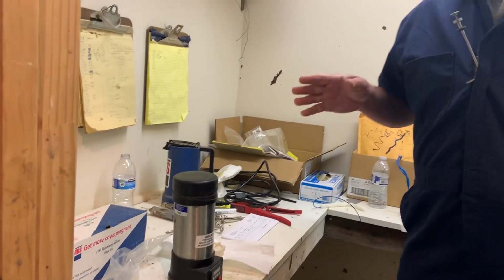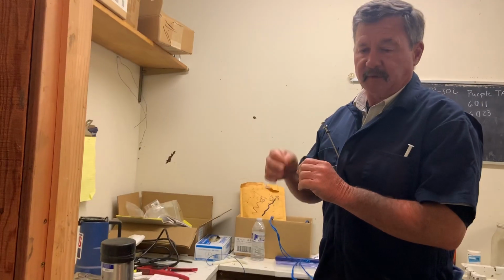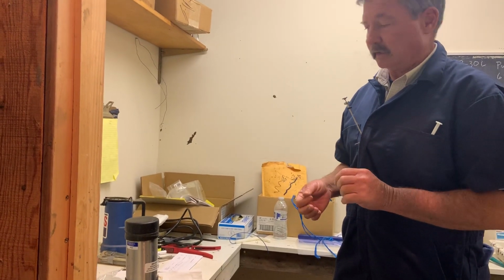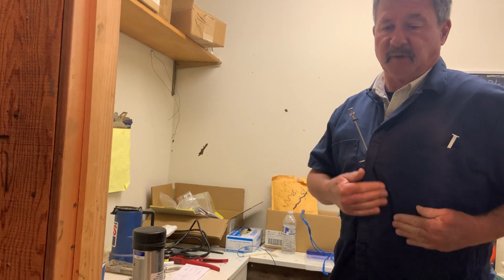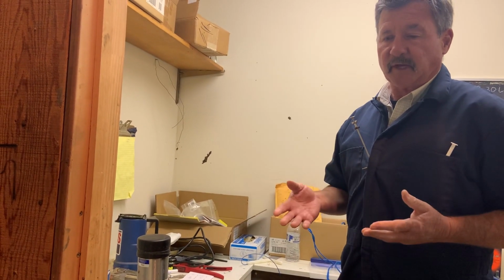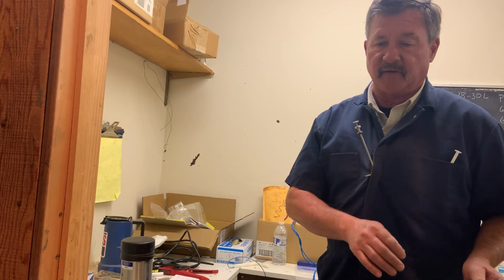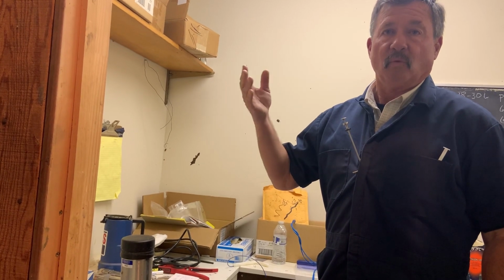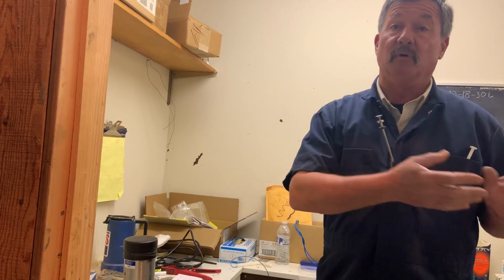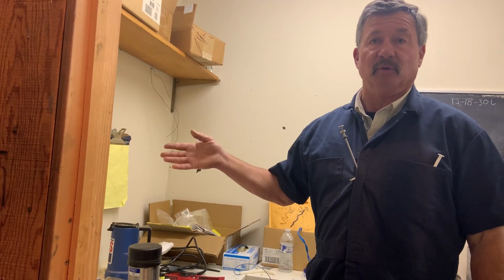And then once it's thawed out, we're gonna pull it out, dry the straw off so that it's completely dry, because we don't want any water contaminating anything that we're going to put into the heifer. You can see I've got my gun inside my coveralls here, so that's keeping it close to body temperature so it's warm. One thing we don't want to do is heat shock any of the sperm. We freeze the semen because then we can have it here available anytime we want. So you can be breeding your heifer to maybe a really well-bred bull that you couldn't afford to buy, but you can afford to buy the semen out of him. And so that's why they've developed the techniques for freezing the semen, so that they can sell it to many more people as opposed to just selling the bull to one person.